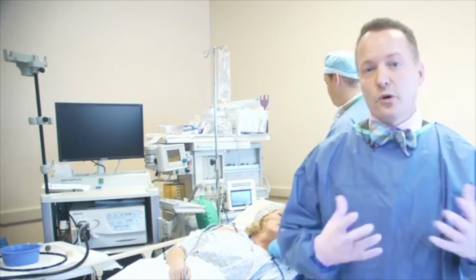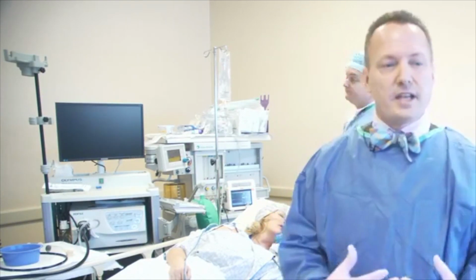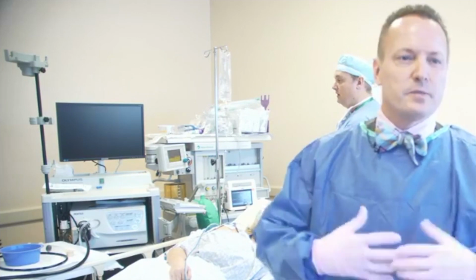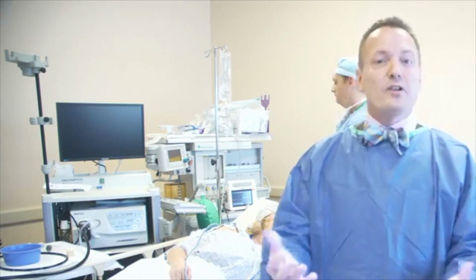So some people will notice, the question, just so I can reiterate that, was how does the balloon feel when it's inside? Initially, some patients will notice the balloon, but it then becomes part of you. And so it feels very natural. In fact, most patients will say that they don't even know that it's in place after the first few days.